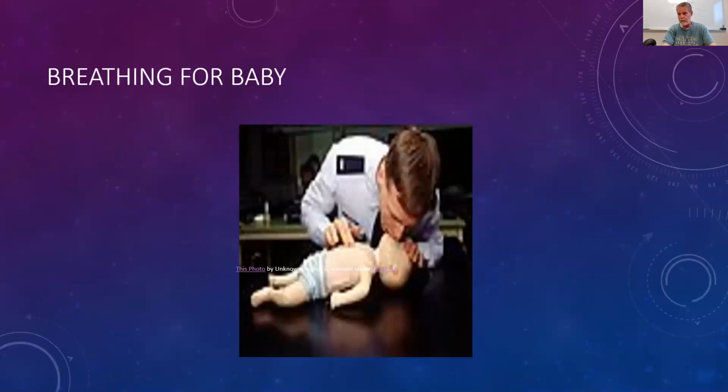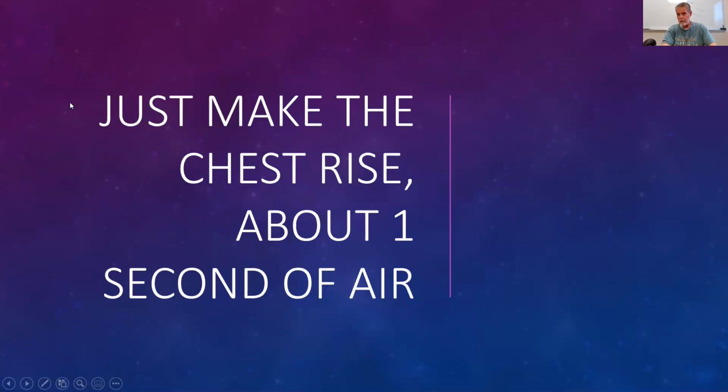How that may actually look is demonstrated on the slide here, where we're actually breathing for the baby. Again, you would be encouraged to breathe for that infant and child if it is, of course, safe to do so. Now, a little bit more on the breaths just because they're important, and this is such a key part with all CPR. It's just making the chest rise.